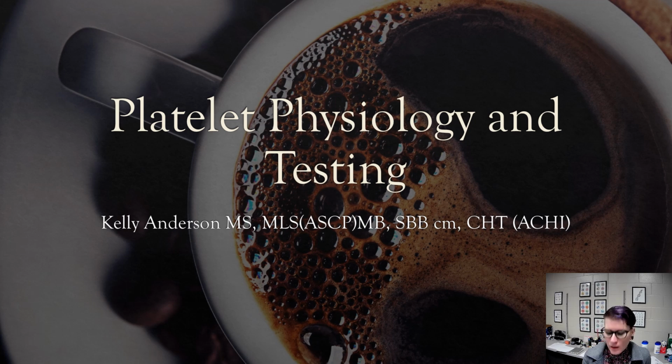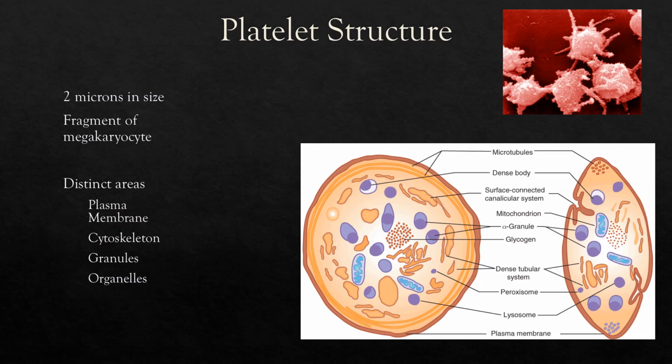Hello, today we are going to talk about platelets and how we test for platelets. Platelets are only about 20% the diameter of red cells. The normal platelet count is 150 to 350,000 per microliter of blood. Since platelets are so small, they make up just a tiny fraction of the blood volume. The principal function of platelets is to prevent bleeding.